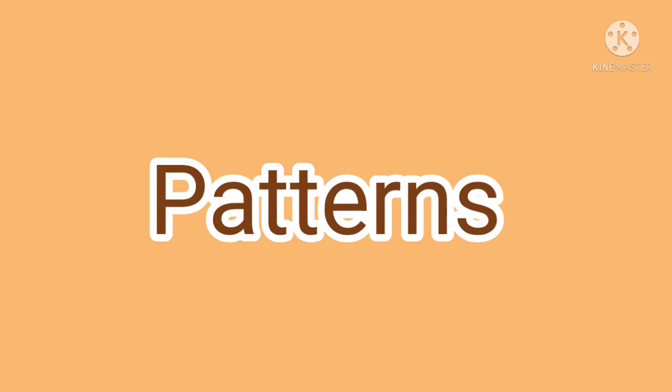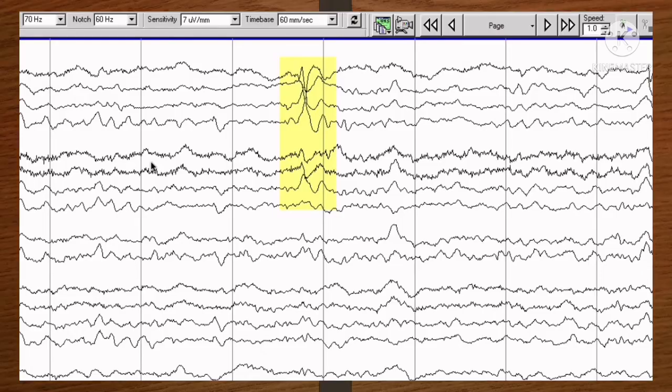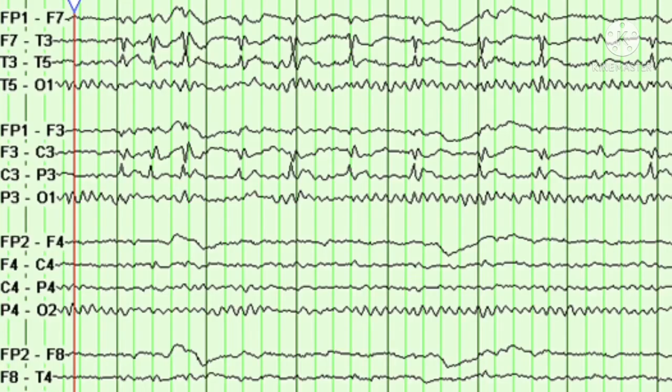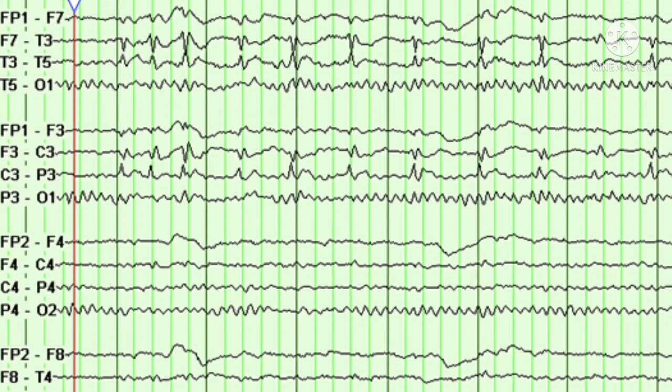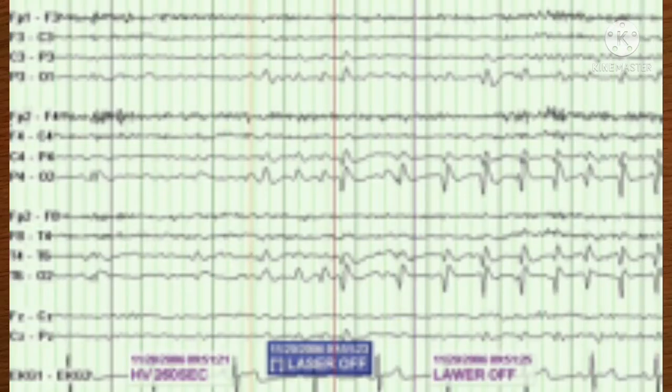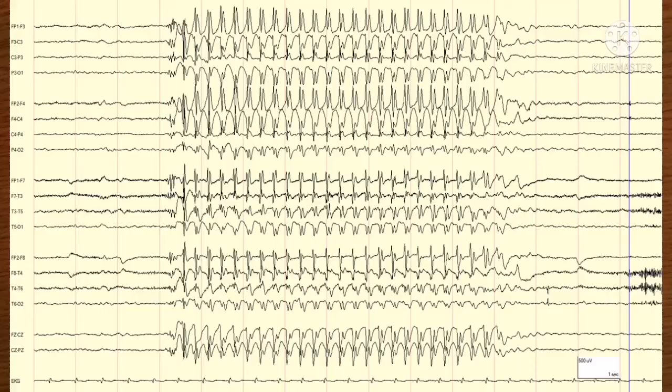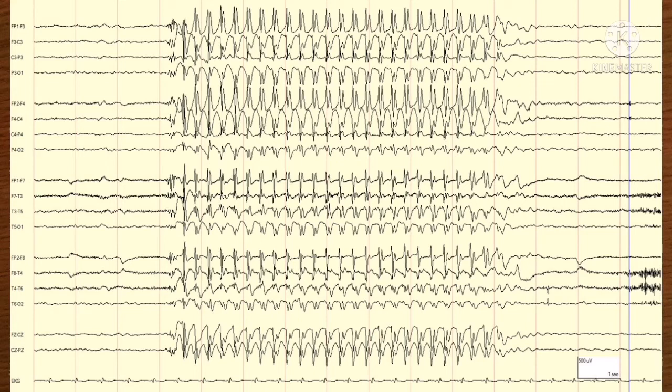Let's see some of the patterns related to abnormalities or specific syndromes. Starting with rolandic epilepsy, we have a stereotype spike often with triphasic appearance followed by slow wave, independent discharges with maximum amplitude near C3 or C4 activated by sleep on top of normal background. The second one is occipital epilepsy when there is unilateral or bilateral high amplitude occipital spikes, which are increased by light sleep and suppressed by eye opening. Absence epilepsy, we have the classical 3 hertz spike wave complexes or very uncommonly we may have polyspike wave that increases by hyperventilation and this will disorganize during sleep.